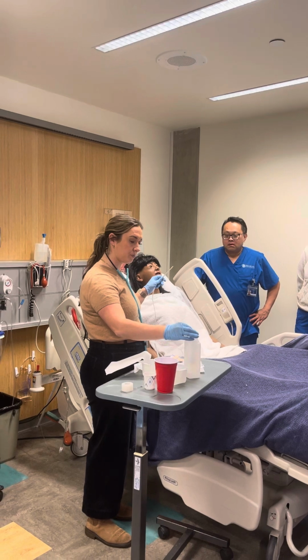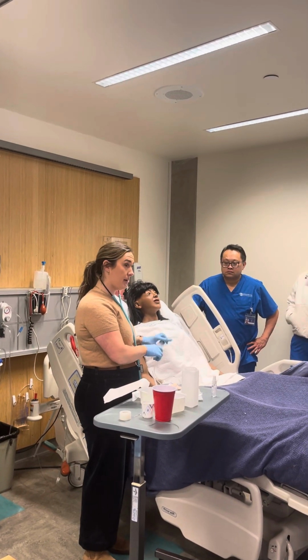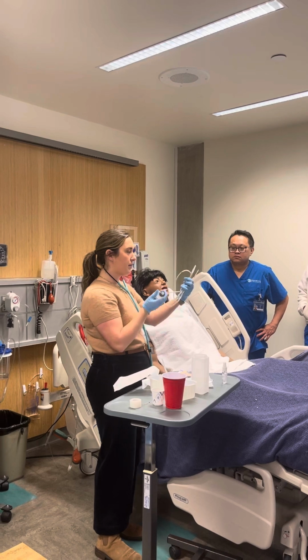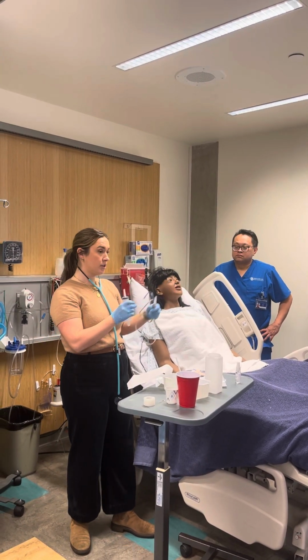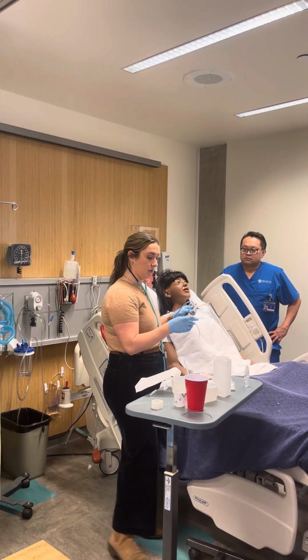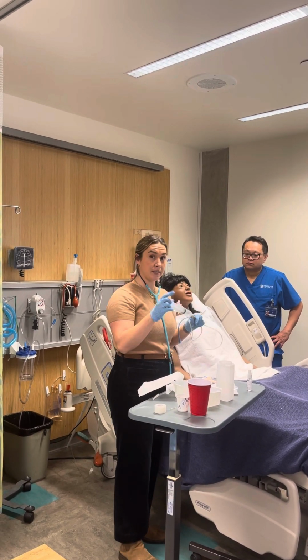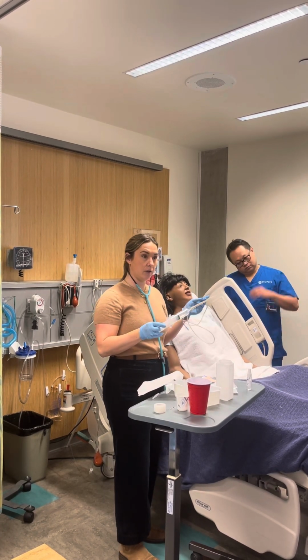In order to aspirate GI contents for your pH strip, you need to be able to aspirate, which means you need to connect your 60 cc syringe ahead of time. Notice that my NG tube comes with this little connector. This connector is for suction, so you're just going to take that off, set it aside, and not lose it. Then you're going to have this on here. I like to have a little bit of air because for my clinical purposes, I like to check air to make sure I'm not in the lung.